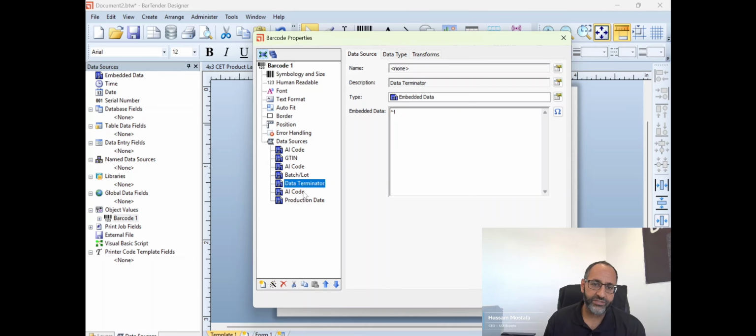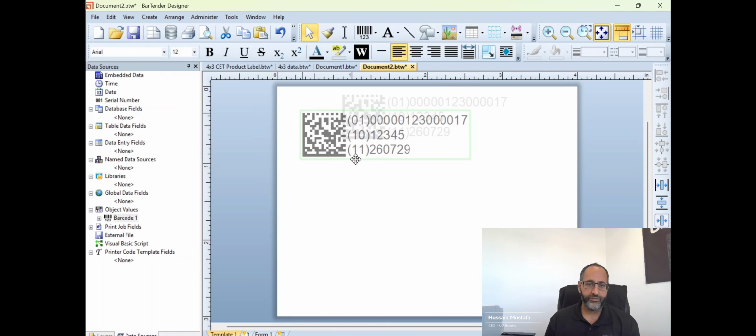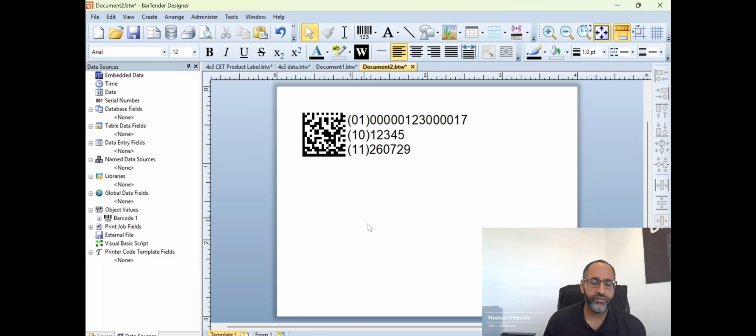So let's see if this fixes it. So basically it's saying, okay, here's the GTIN, here's the lot. After the lot, go ahead and go to the next row and put the production date. Let's see if that works. There it is. It actually works. So now we have the GTIN, global trade item number, lot number, and we have the production date. So that's great to have all this information for the medical device.